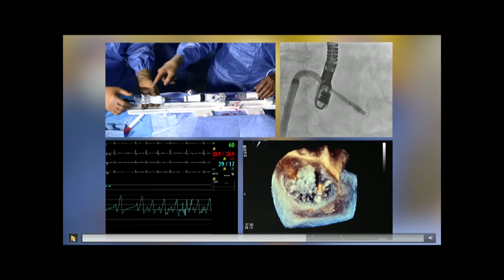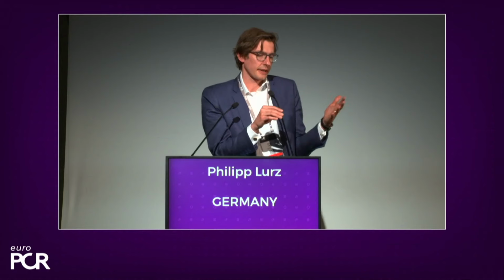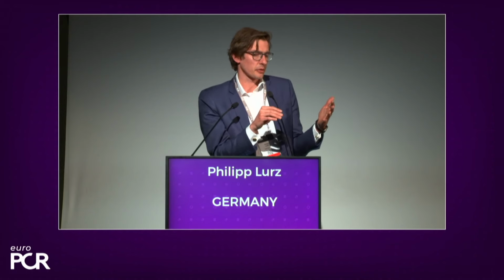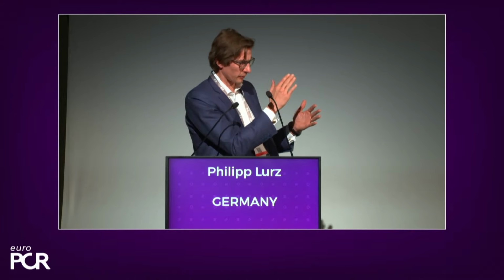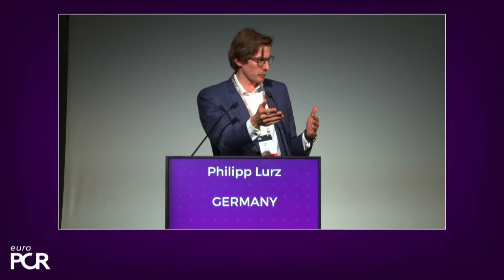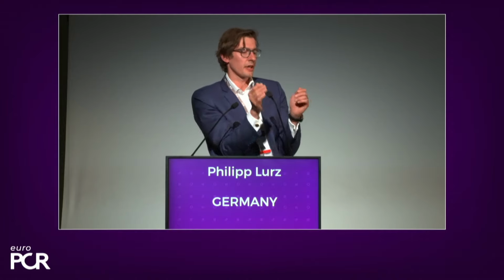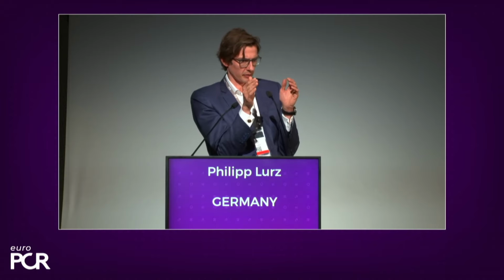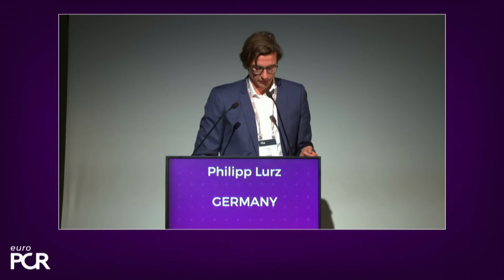Okay, go for it. It's just, at that point, did you think about the clocking of the device? Yeah, that's part of the opening of the device, right? Because once it's closed, sometimes it's more difficult to appreciate whether the clocking is perfect or whether the clocking stayed exactly the same. That's why the idea was to open it up, maybe correct the clocking, but also move in a little bit more medially. Because although we did not have a lot of residual MR, we could see that there is still prolapsing or flail tissue, and that was the rationale behind it.